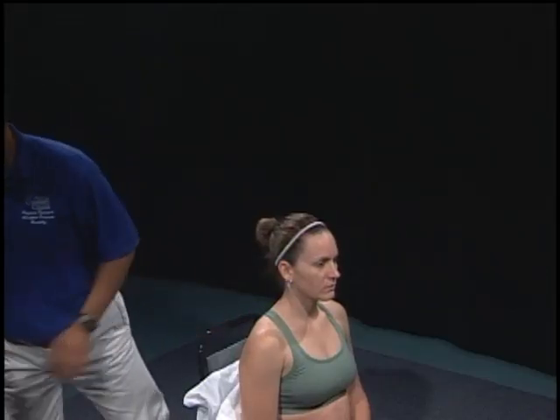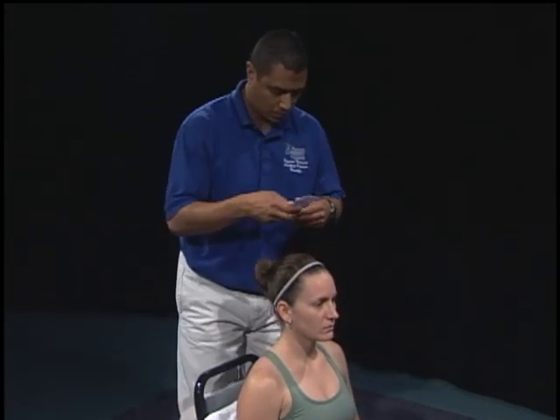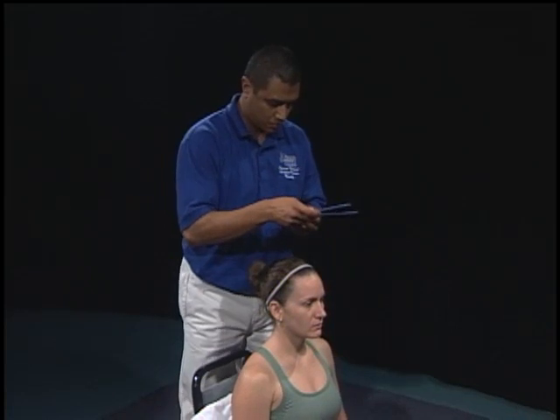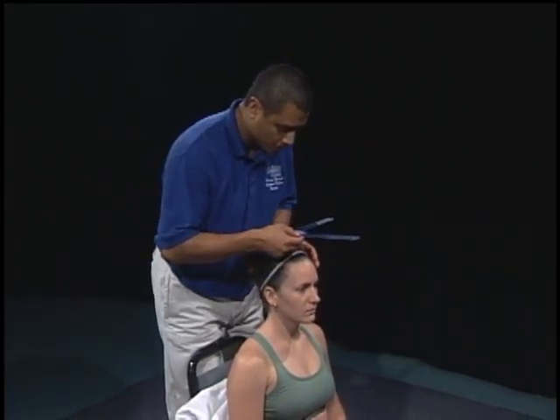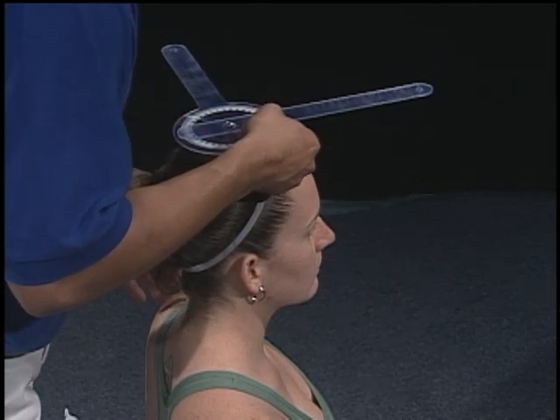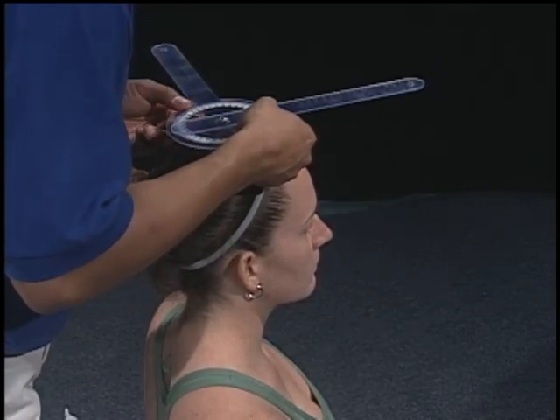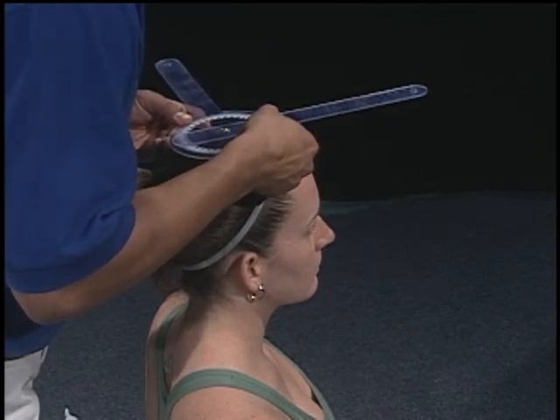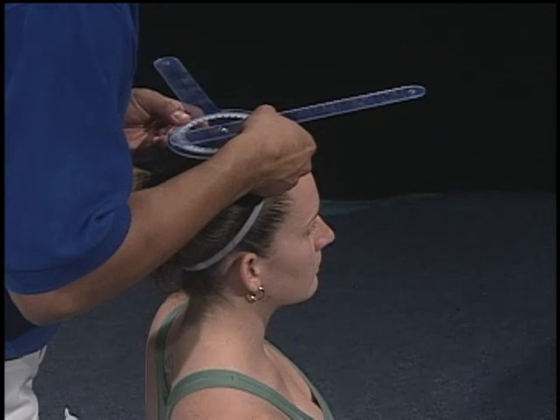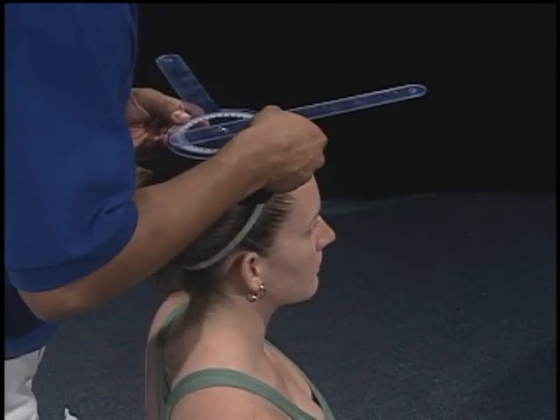You're now ready to measure the joint range of motion. Make sure you expose the bony landmarks you'll be using. Align the axis of the goniometer over the center of the cranial aspect of the head. Align the stationary arm parallel to an imaginary line between the two acromion processes. Align the movable arm with the tip of the nose. If a tongue depressor is used, align the goniometer parallel to the longitudinal axis of the tongue depressor.